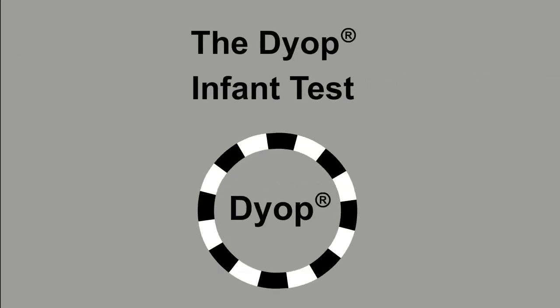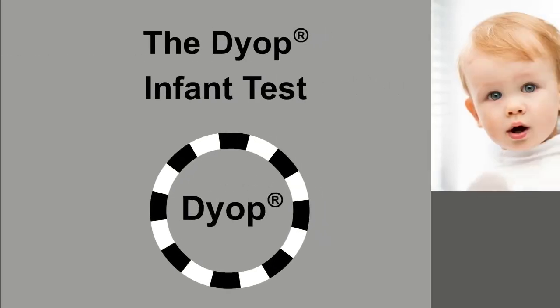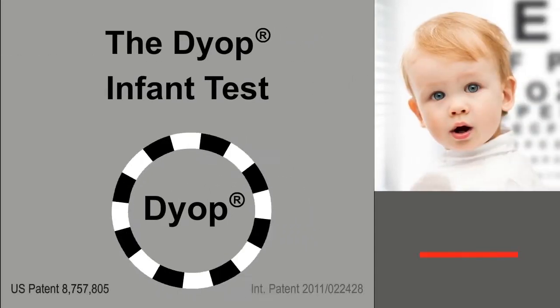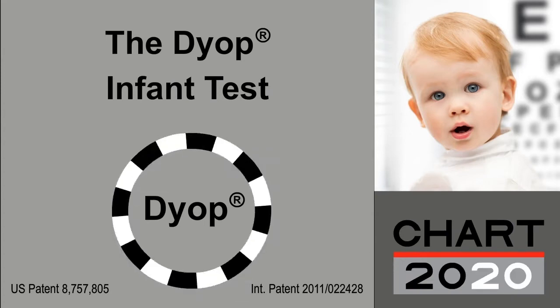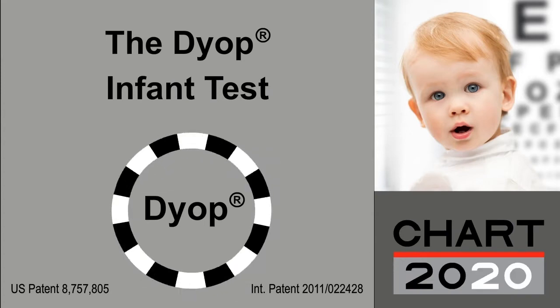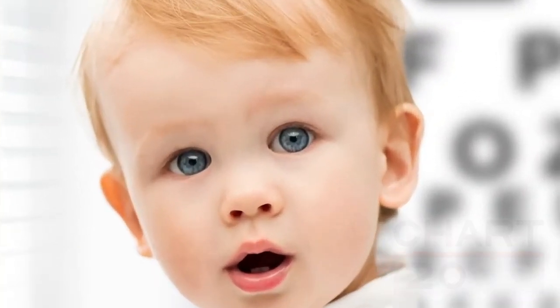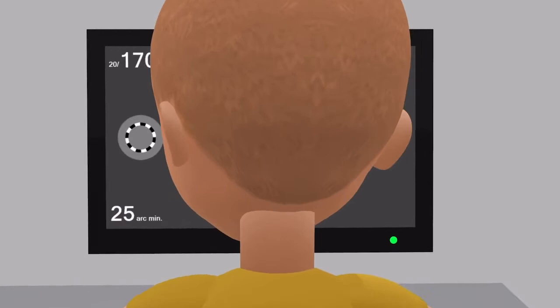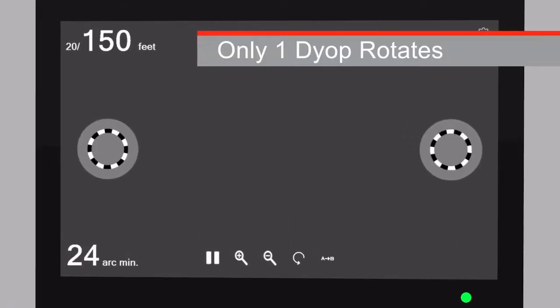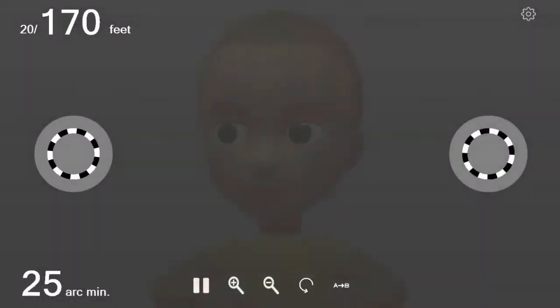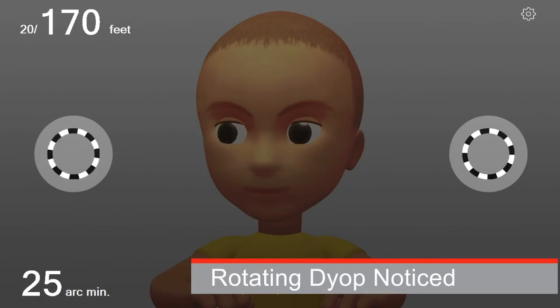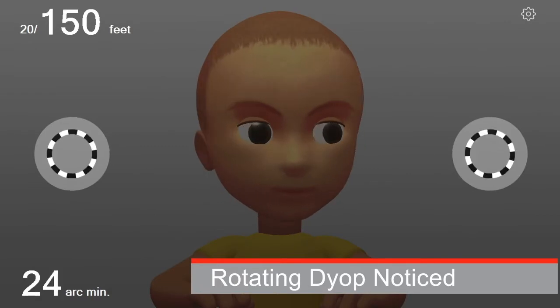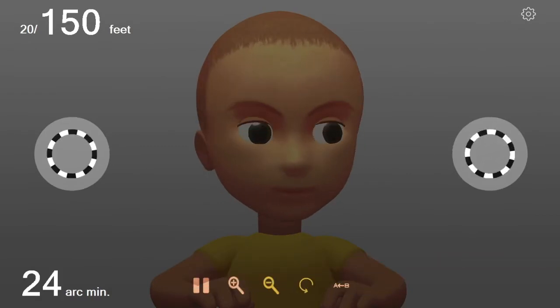The DIOP infant test is a rapid and simple way to measure visual acuity of an infant, child, or nonverbal adult. Identical sized DIOPs are displayed on opposite sides of the monitor, but only one of them is rotating. The typical response is to notice the one which is rotating rather than the static DIOP.